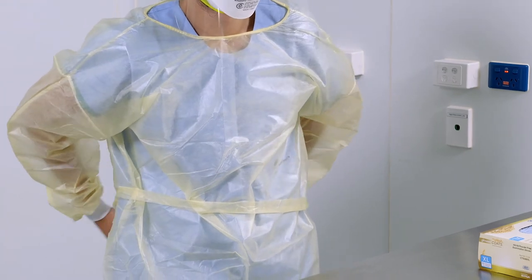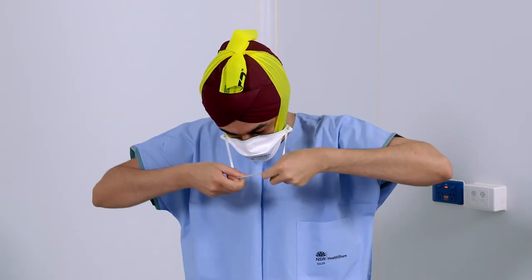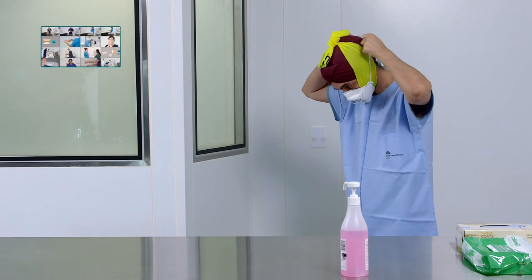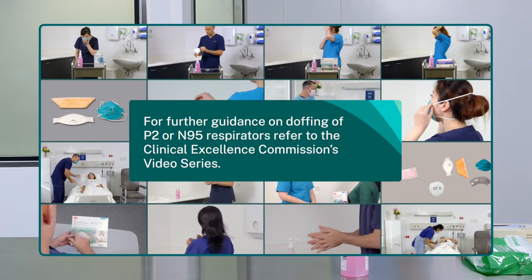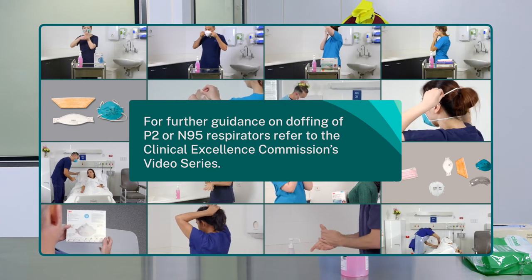Doff other PPE as per local guidelines. Remove your respirator and discard as per standard procedures. For further guidance on doffing of P2 or N95 respirators, refer to the Clinical Excellence Commission's video series.